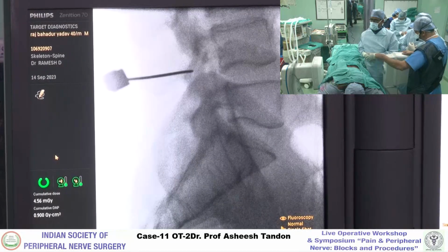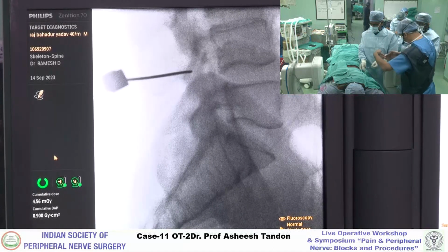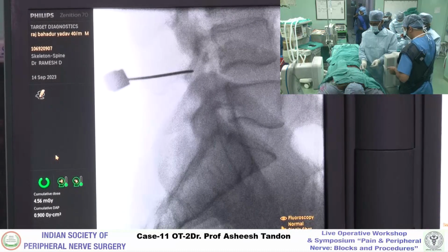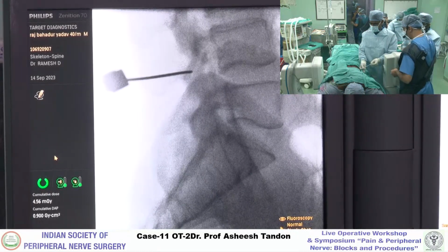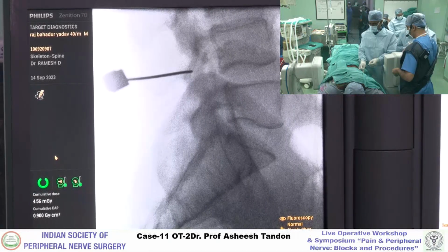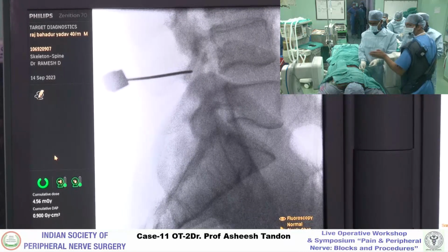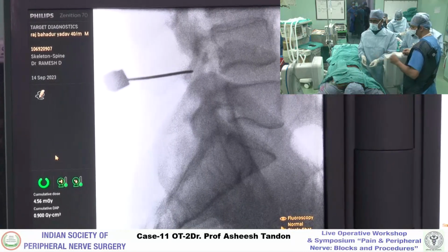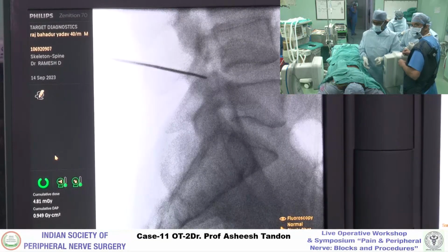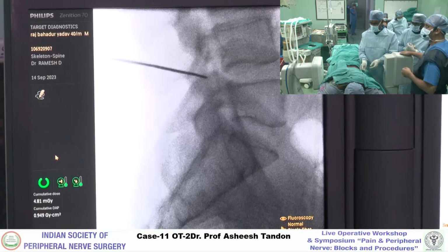Still again, pull out. Bring your hand here, don't take it there. Go further up, now go. That is the iliac crest. Yeah, shoot, but you won't be able to see the crest here, so you'll have to do an AP for that. Anyway, take an AP shot.